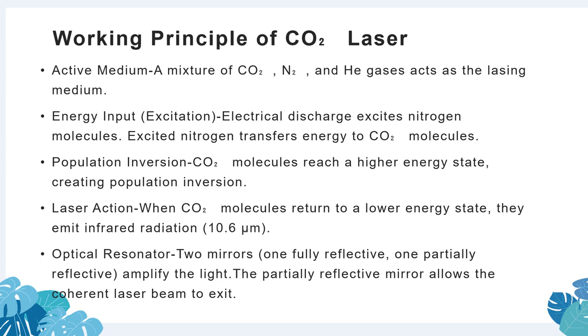It produces infrared light of 10.6 μm, which is strongly absorbed by water in tissues, making it ideal for cutting, vaporizing, and coagulating soft tissues in medical and surgical applications. Mostly, CO2 lasers are used for surgical applications in medical purposes. Okay, then let me move to the laser action.